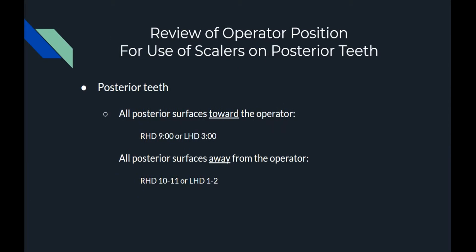Review of operator position for use of scalers on posterior teeth. Posterior teeth. All surfaces toward the operator, right-hand dominant 9 o'clock or left-hand dominant 3 o'clock. This position is mandatory for sextant 1 buccal for right-hand dominant operators and for sextant 3 buccal for left-hand dominant operators.